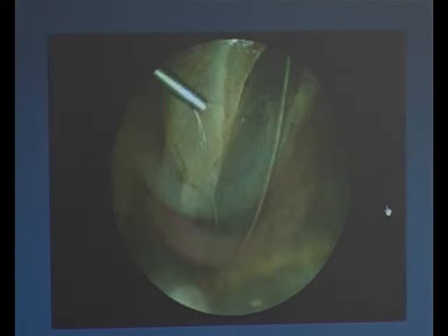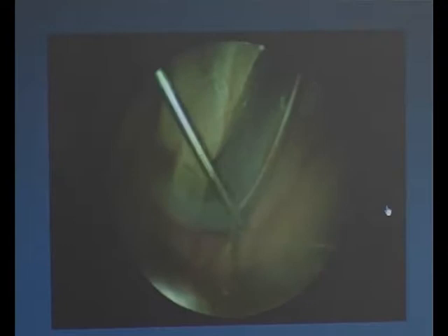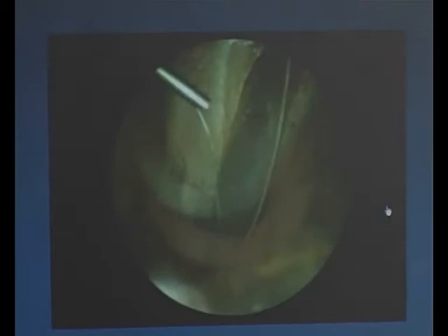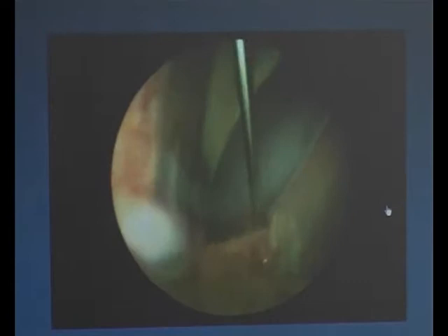Yeah, there it comes, and then you can see if you go straight, then you've got a false fixation. There's the fat, and there you place the applicator. I think it's quite clear. You're coming with the applicator, you have a look at the abomasum and place the applicator and then you're fine. Yep.